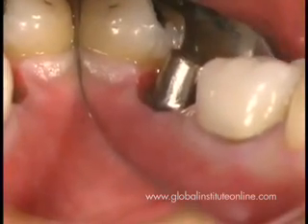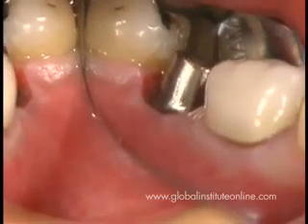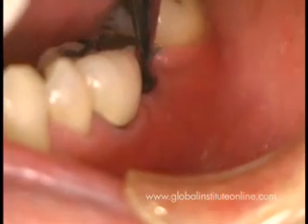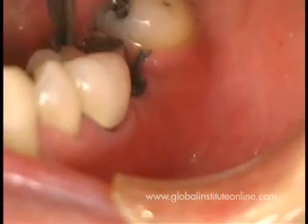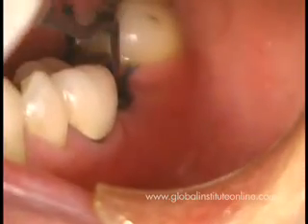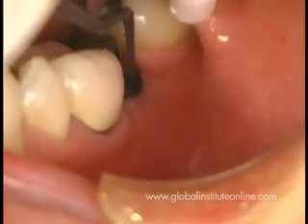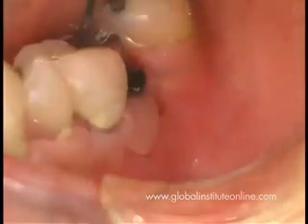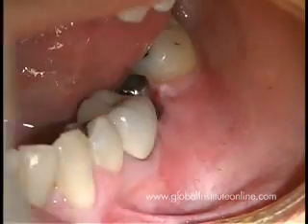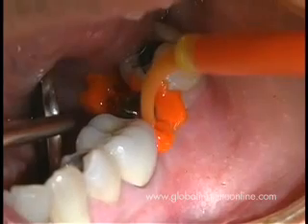As you can see here, a slight subgingival preparation has been made with a sufficient chamfer so the crown can be placed. Then a subgingival cord is being applied to allow for just minor amount of gingival displacement so we can now pick up this margin in the appropriate impression technique. Careful positioning this cord is important, as the cord can of course be displaced deeply into the site.